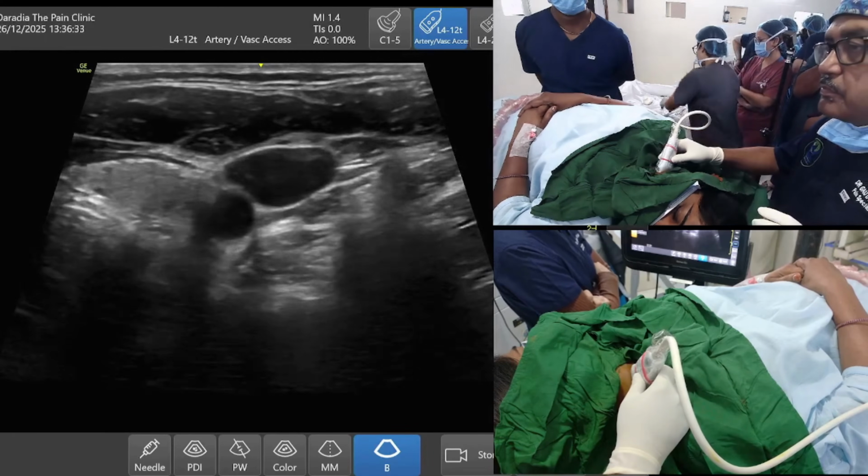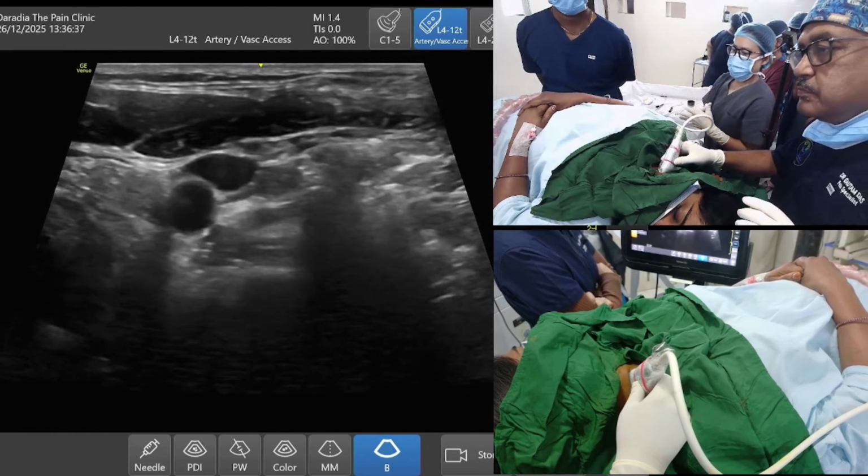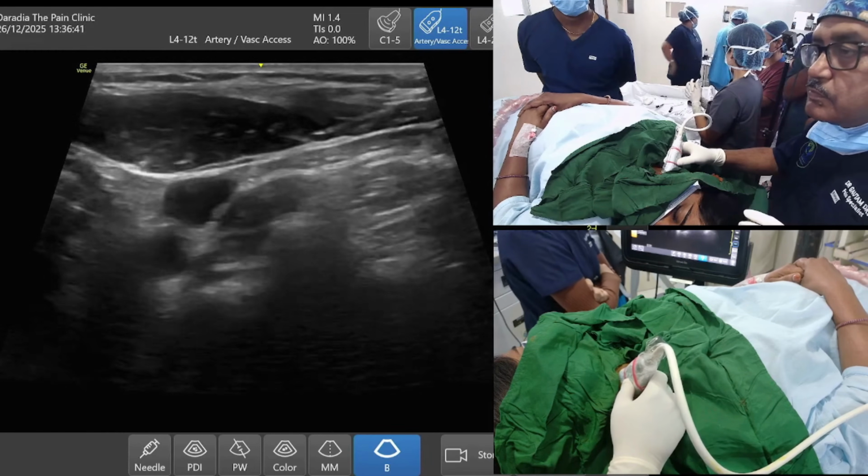In this video, we will demonstrate the USG-guided technique of stellate ganglion block in a patient with CRPS of the upper limb.